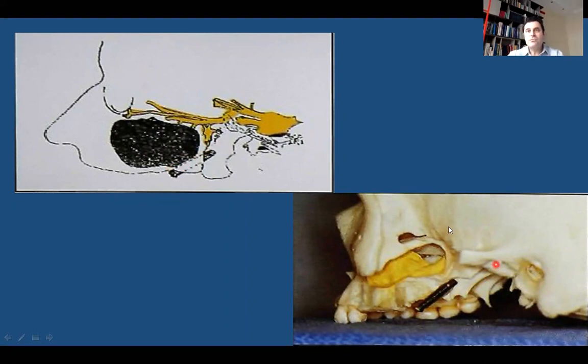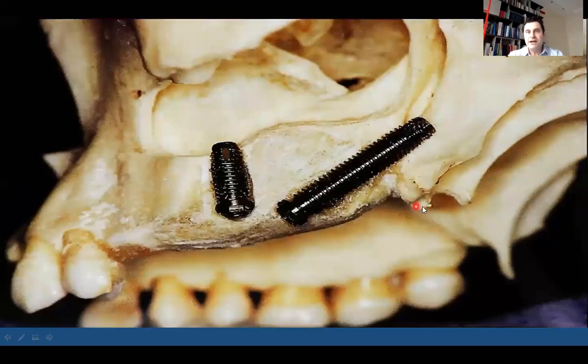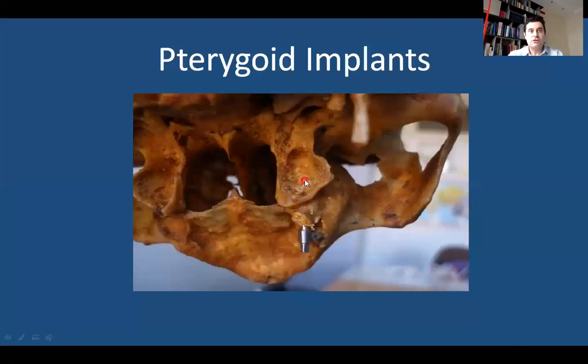But let's see which is the landmark to establish the direction of our pilot drill. The hamular process of the medial pterygoid process is easily palpated in the oropharynx. This process guides the clinician to determine the thickest part of the pterygoid pillar of the bone, usually in the central part of the two processes. Usually, 5 millimeters lateral from the hamular process and 10 to 14 millimeters above the most caudal point of the pterygomaxillary suture, we can find this thickest part of the bone. 1-2 millimeters of the apical part of the implant could emerge into the pterygoid fossa because no vital structures are present in this area.